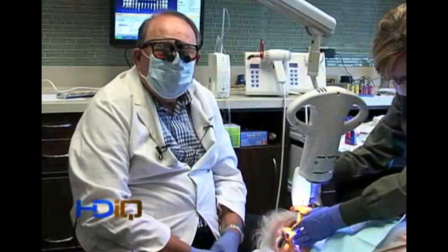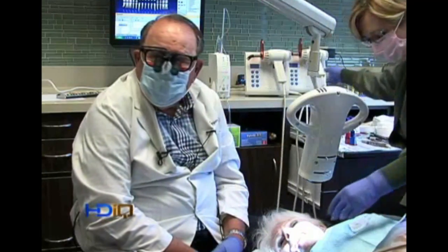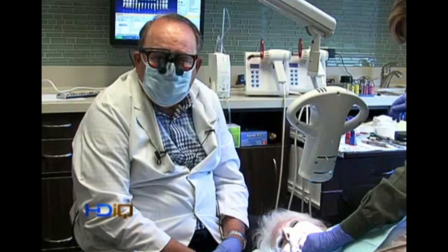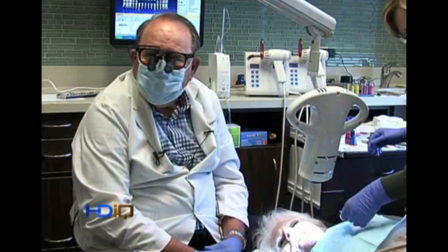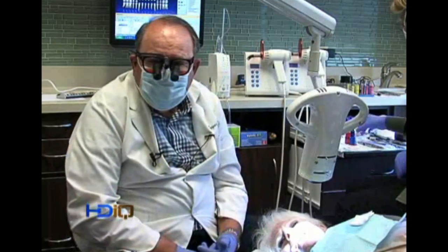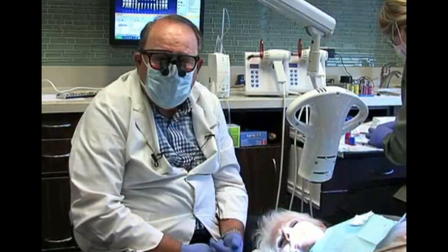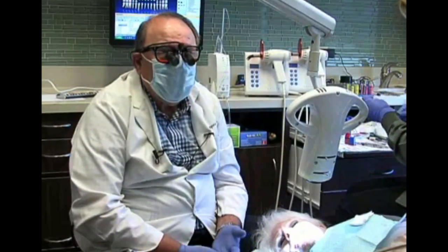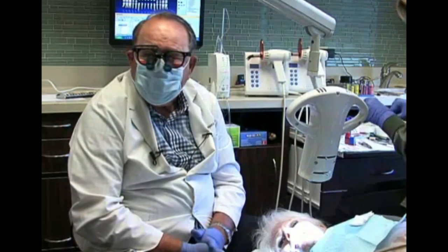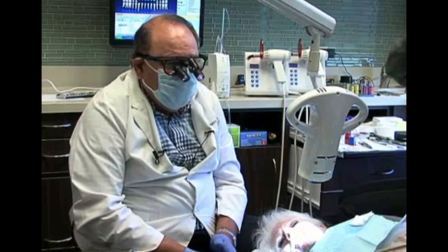We're going to start with a flowable because one of the problems people have is getting material to stay on the tooth surface. When sculpting paste material, it tends to come away. Number one, you should be using titanium-coated blades like the Cosminet instruments, which come in all shapes and forms that will get you underneath the free margin as well as for application. You need an instrumentation system like that.